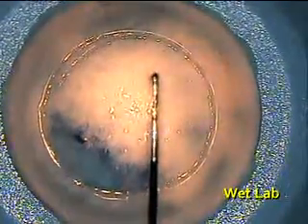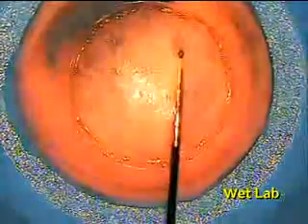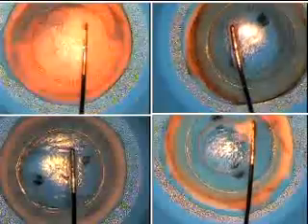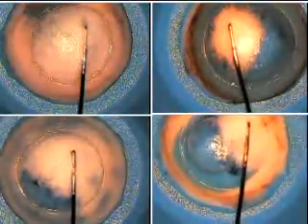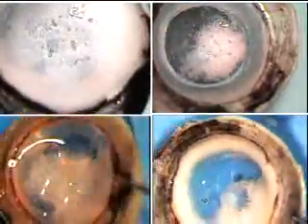In the wet lab, we studied extensively on failure of formation of big bubble. We tried to realize what happens at the deeper layer of cornea, what changes take place there. We also thoroughly observed the changes occurring at the posterior surface of the cornea. We noticed multiple tiny bubbles of various sizes and at various depths of the cornea.